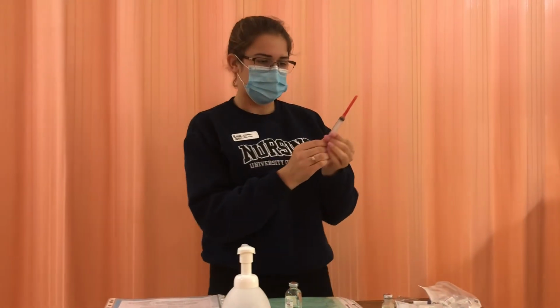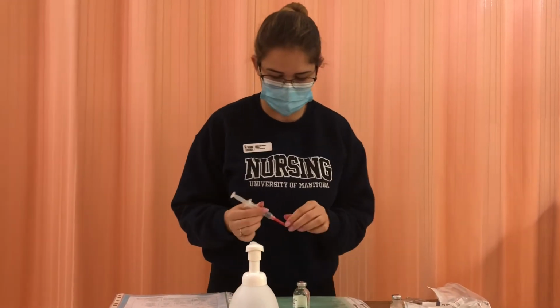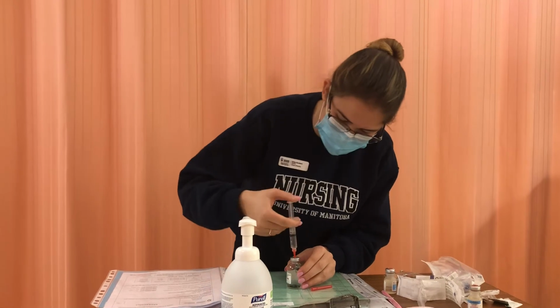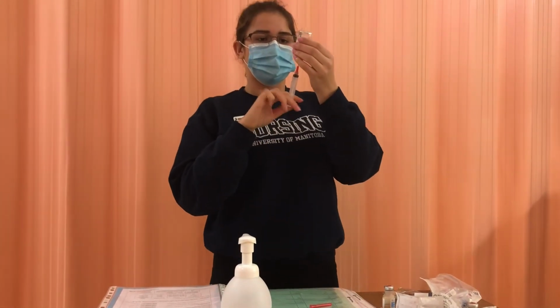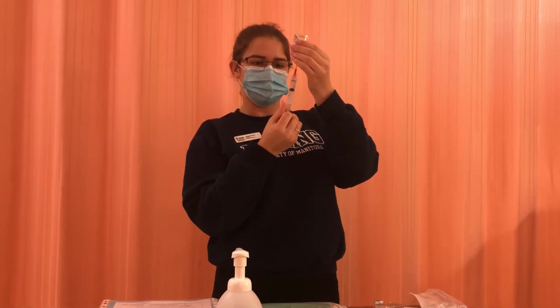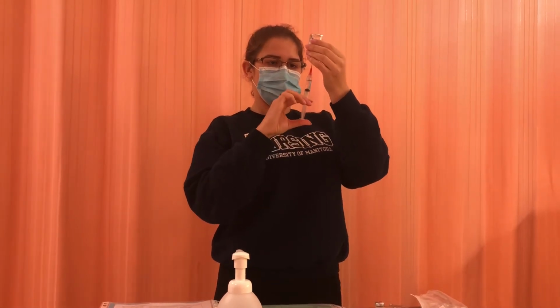So now I'm going to draw up 3 mLs of air into the syringe, and now that it's been mixed and the top is clean, I'm good to insert my needle. I'm injecting my air and I'm going to pull 3 mLs of water. It's due today and now, and it has not been given yet, so I will be giving the dose now. And the drug is not expired.